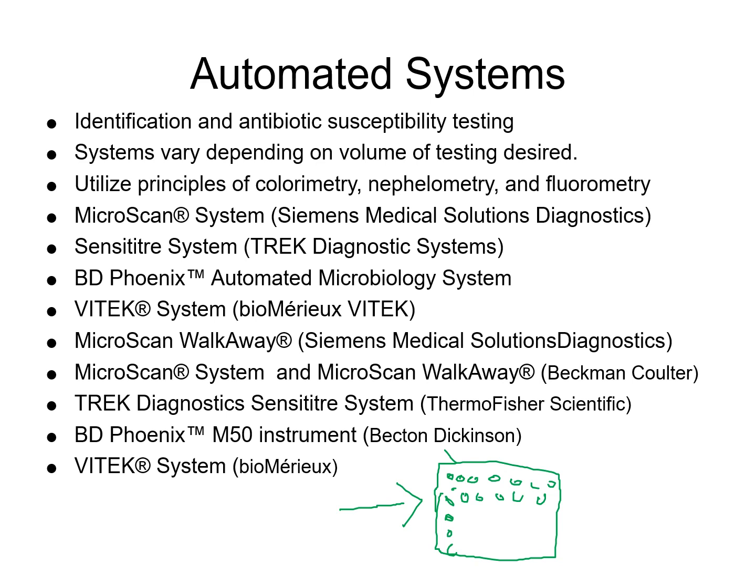And it's really useful when you're doing the antimicrobial susceptibility testing, because a large portion of your plate will include various antibiotics, and you're looking to see which one of those will actually work. So this is really good. It speeds up the process, and it helps us to get results to the physician just a little bit quicker.